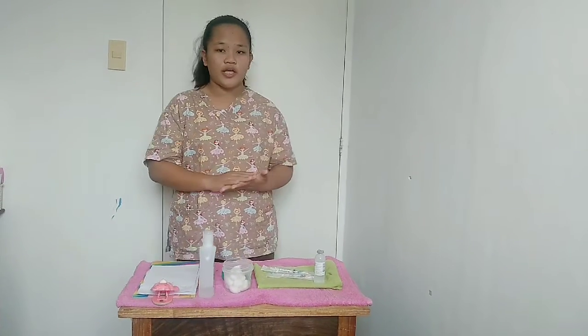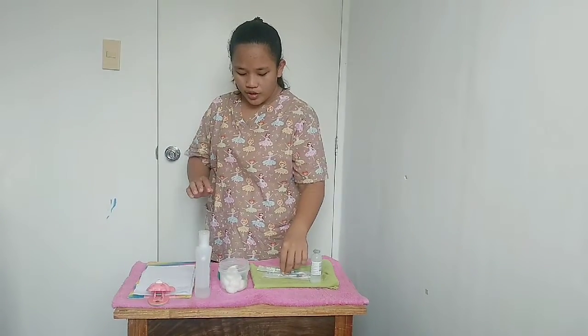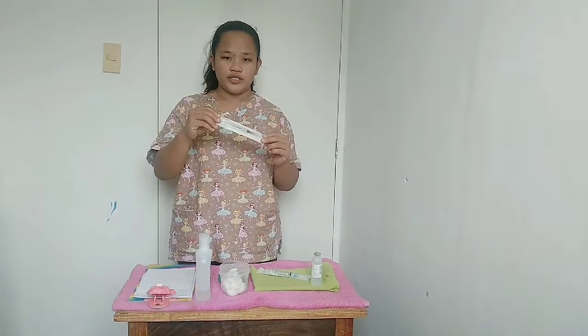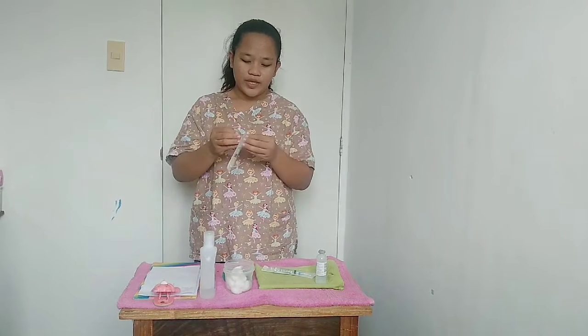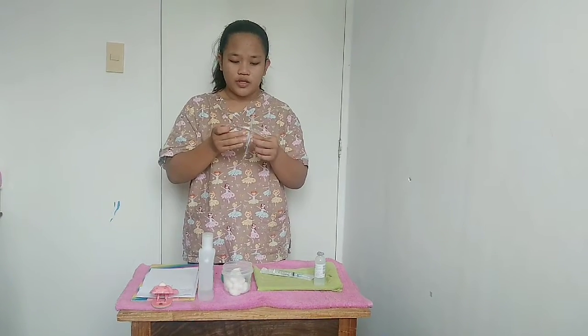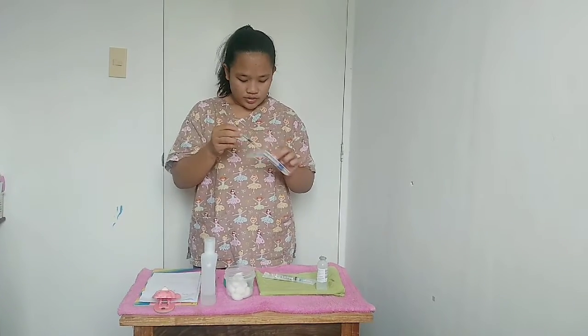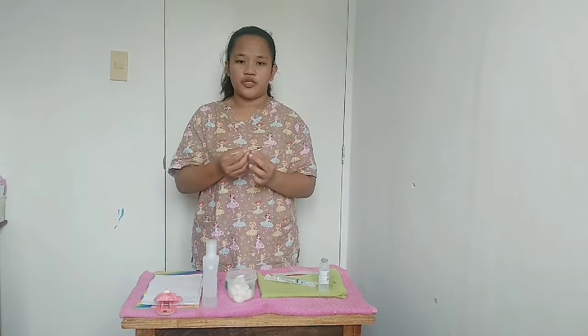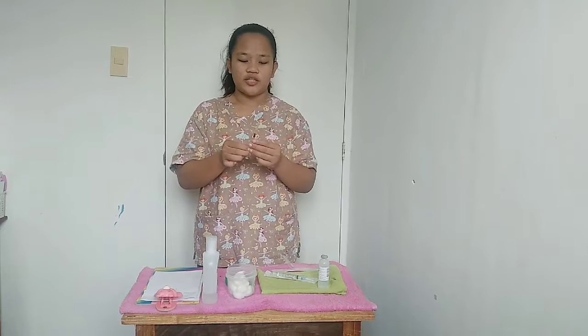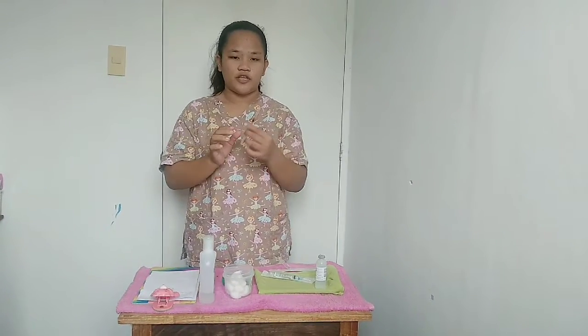To prepare a medication for subcutaneous injection, we have to have an insulin syringe. Open the sterile pack and hold only the barrel and the plunger of the syringe. Do not touch the needle to avoid contamination.